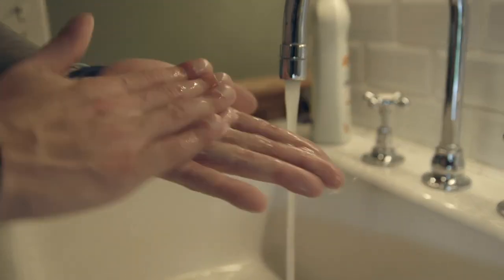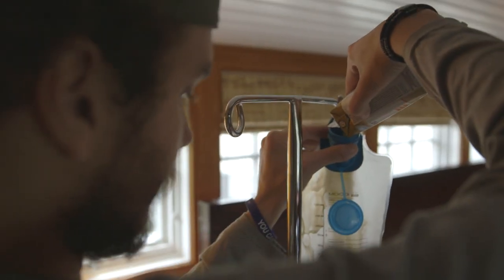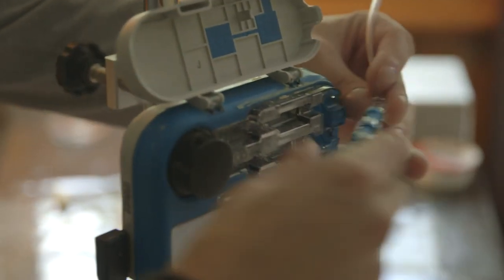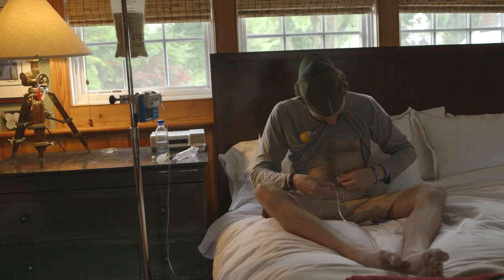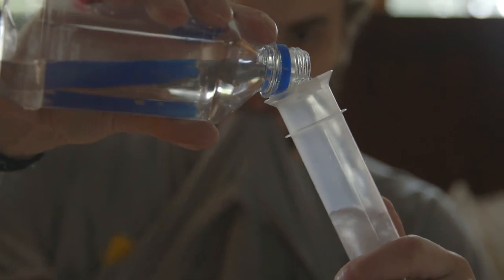Start by washing your hands. Shake the formula well, then pour the desired amount into the hanging bag and close cap. Connect the container to the pump. Connect the tubing and syringe to your button. Unclamp the extension set. Pour room temperature water into the syringe and flush.